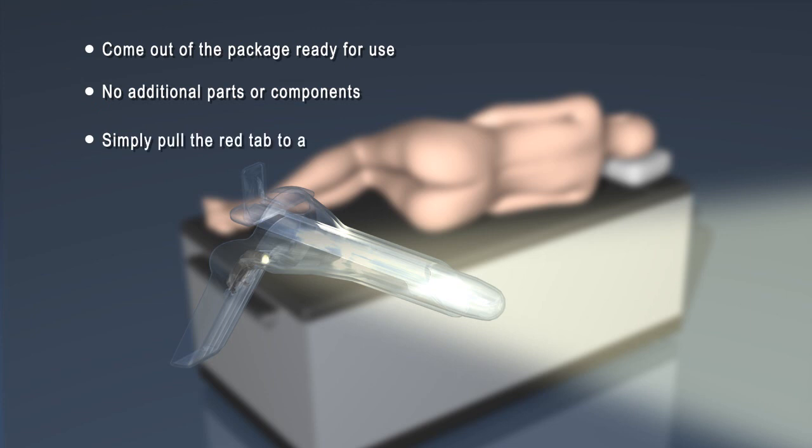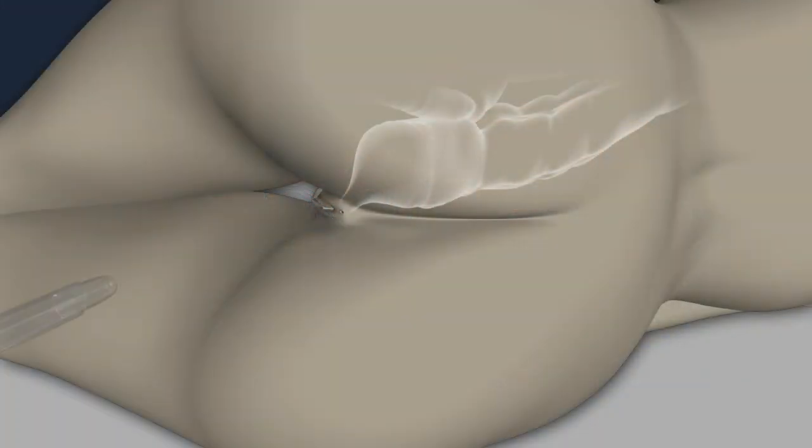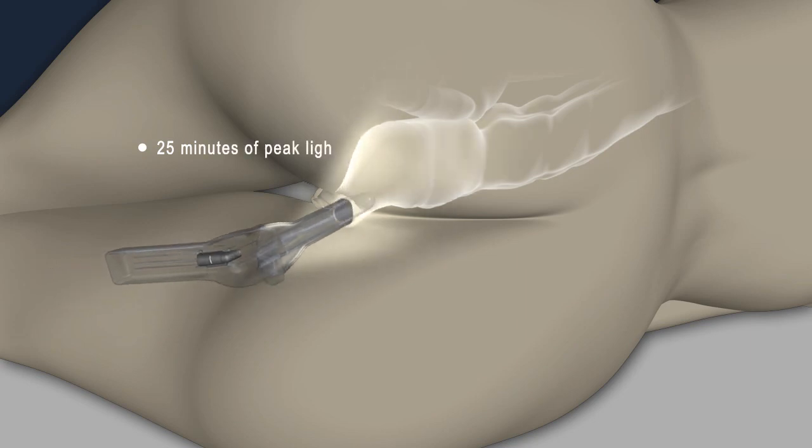Simply open the package and remove the red tab to activate the ultra-bright built-in LED light source. Once activated, the targeted light source will produce a bright white light for up to 25 minutes at peak power.